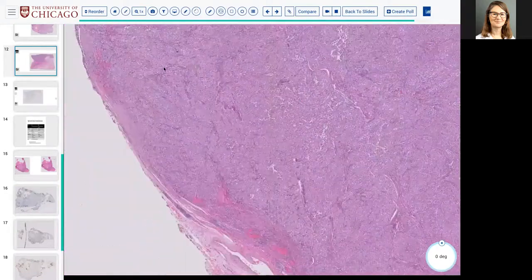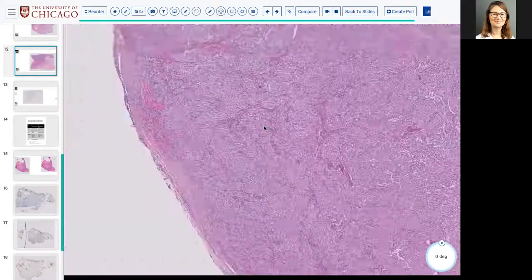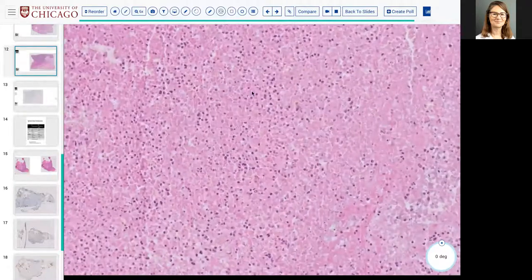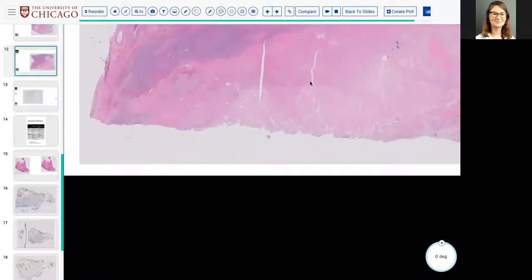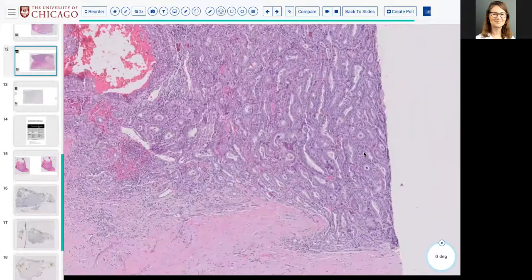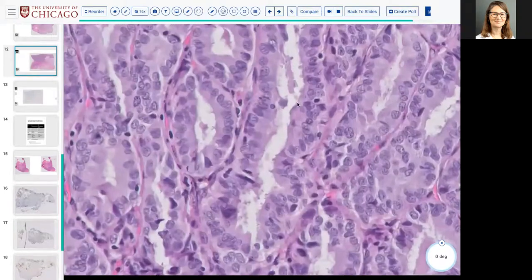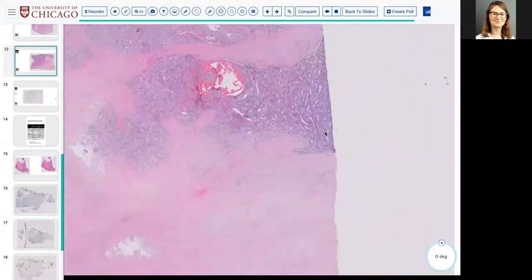So you have something that looks quite aggressive. I completely agree with you. I'd be worried here about a, quote unquote, poorly differentiated carcinoma. And there are giant zones of necrosis here with ghosts of tumor cells. So how do we regard this? Is this PTC with necrosis? Here's actually a nice area that's a little better differentiated for papillary. So we're probably coming from a papillary carcinoma, but we're developing solid growth and we're developing necrosis.